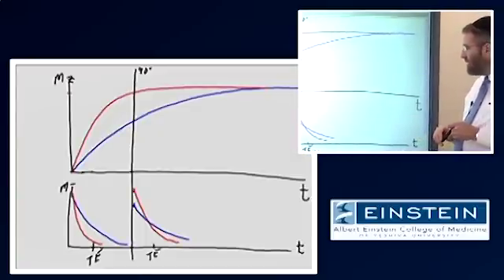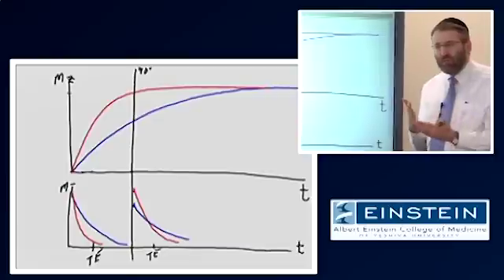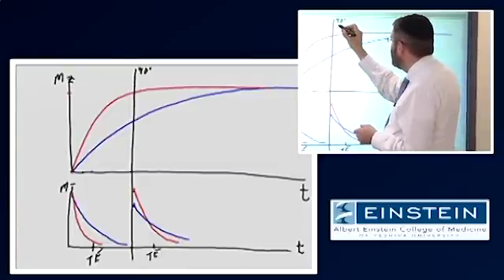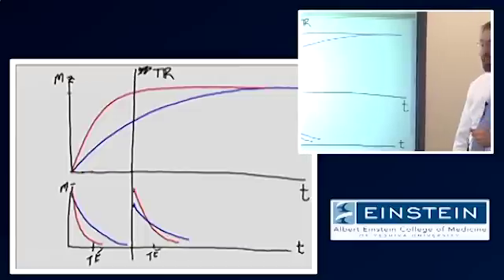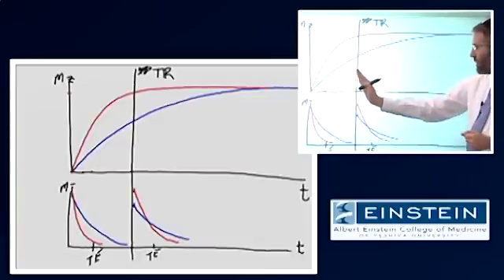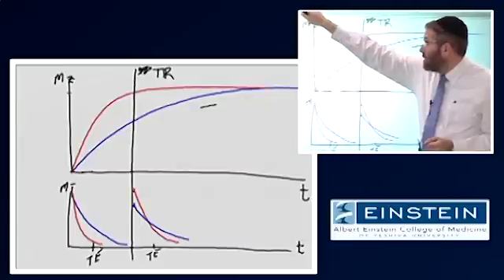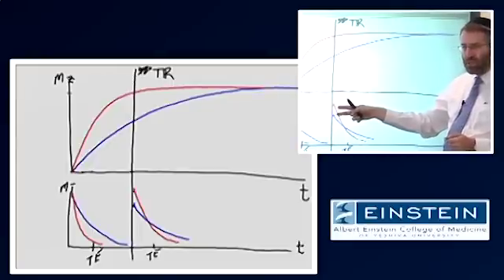So if I want to make my image more sensitive to T1, if I want to see the differences in the tissue that are a function of those two tissues having differences in T1, I want to take this time, and this time is called the TR, or the time to repeat or repetition time. I want to make my TR shorter. If I make my TR progressively longer, then these things are going to get closer and closer together, and I will have less and less of a difference due to differences in T1 embedded in that signal.